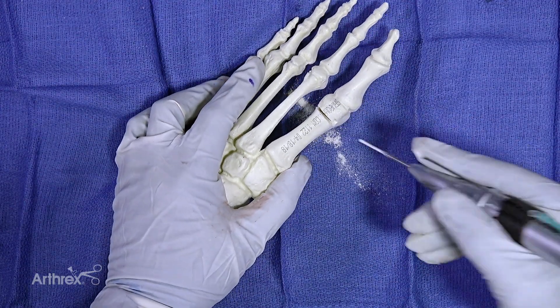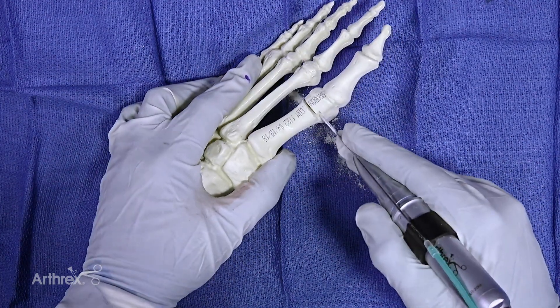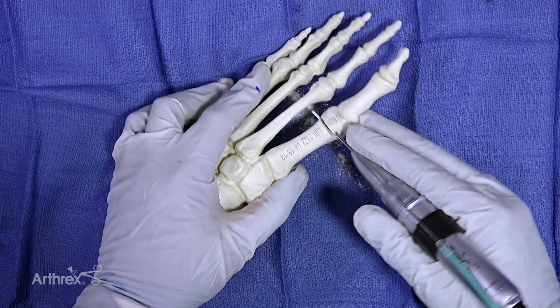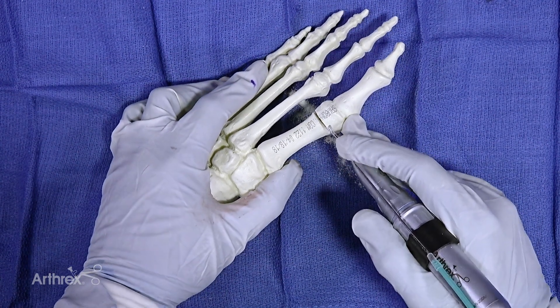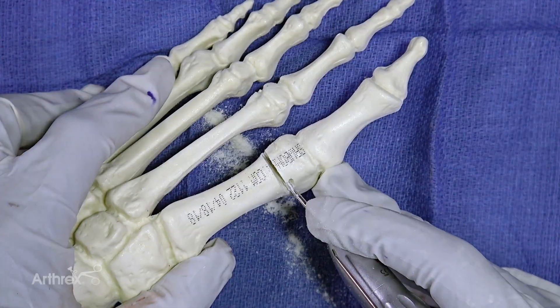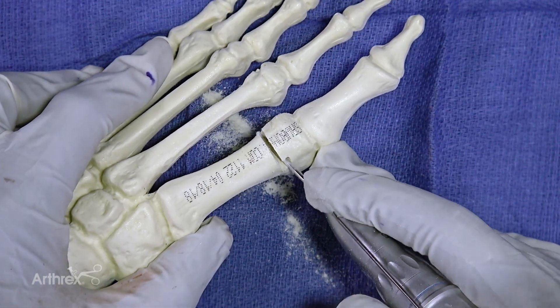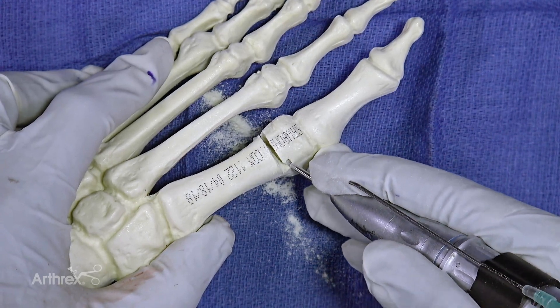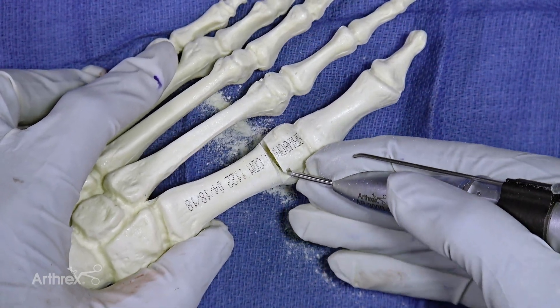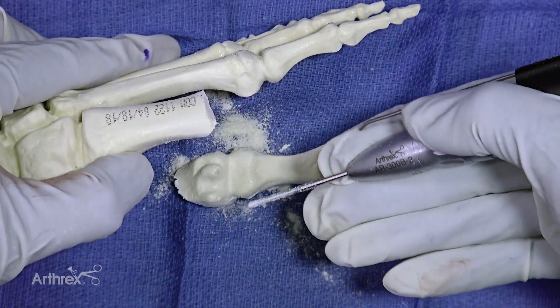Depending on which foot and which hand you're using, you might want to use a farmer's grip or a pencil grip. In this case I'm going to use a pencil grip — it doesn't deliver as much force but allows you to have more control. In addition, I'm going to have my long finger on the toe on the medial border of the foot to give me more stability. So I'm rotating, doing a little bit of sawing, a little bit of rotating — and you can see what my hand's doing there. And there's our cut.